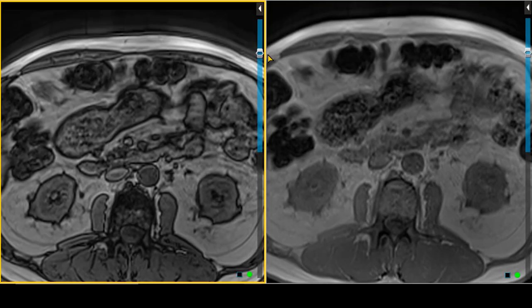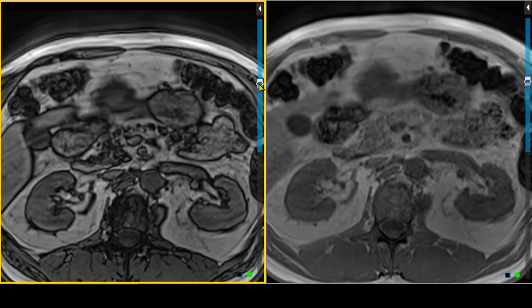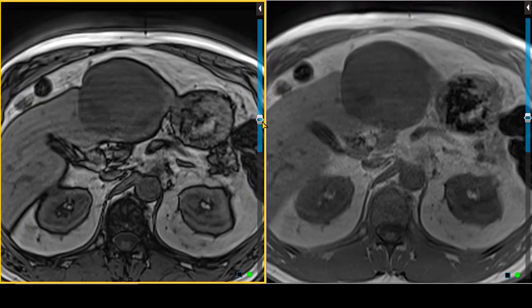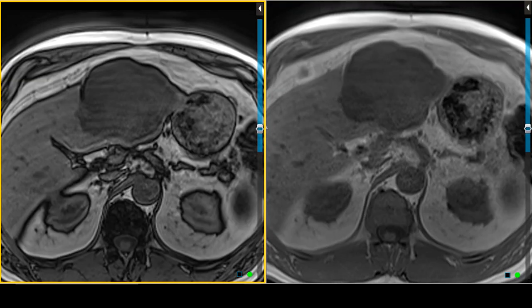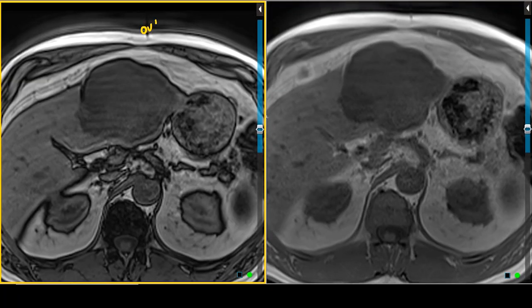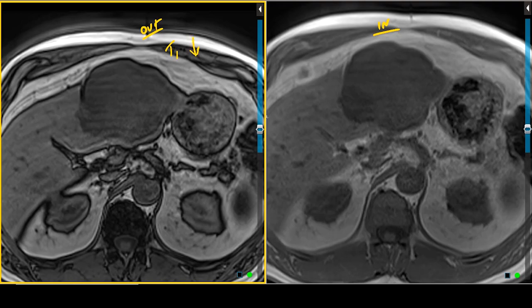The next sequences are the T1s performed both in and out of phase to see if there's any fat or areas of increased susceptibility within this lesion. We identify this large lesion in the left hepatic lobe, and on both the out-of-phase and in-phase sequences, the lesion looks identical — T1 hypo-intense. There are no areas of signal loss on the out-of-phase image to suggest fat, and no areas of increased susceptibility on the in-phase image.